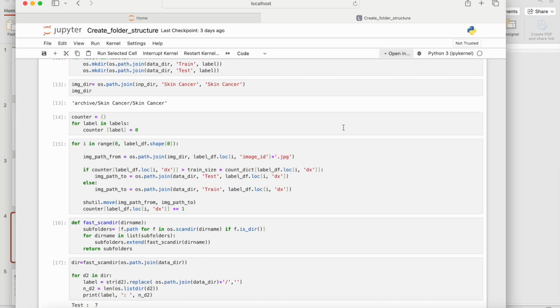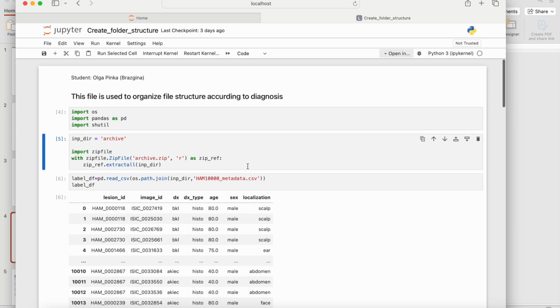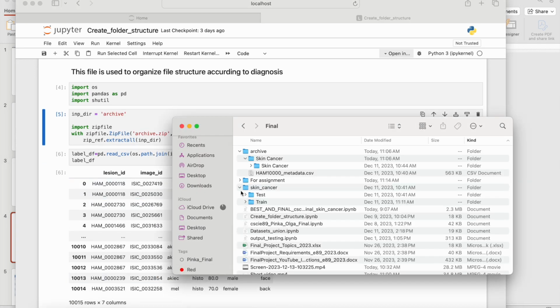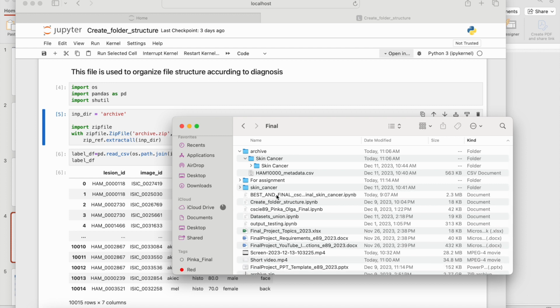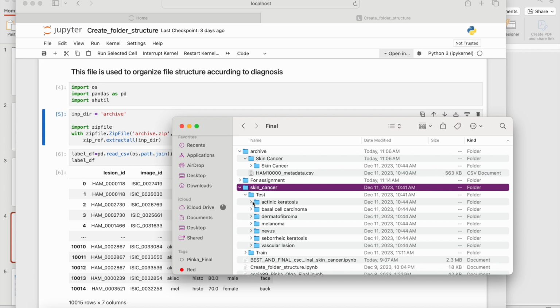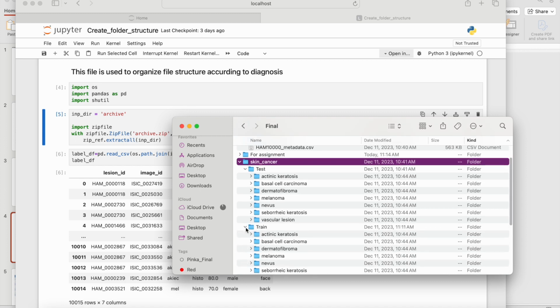To merge these data sets, I created a Python file where I added some code. I extracted one zip file manually, and it had a pretty well structure. I just deleted two folders because the smaller data set consists of 9 classes, and I merged them and used only the 7 classes that were in both data sets.